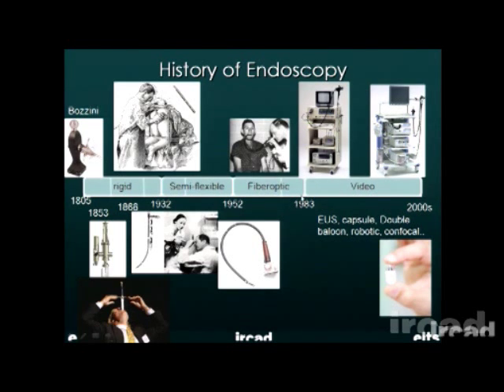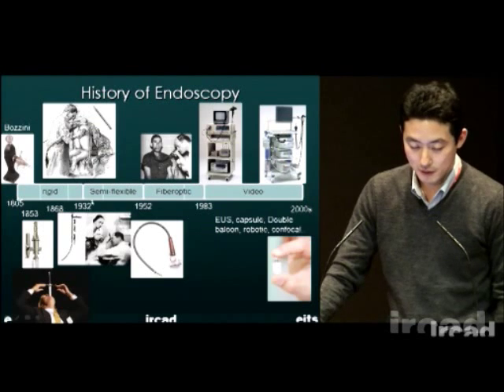In the 1980s, the development of the video endoscope enabled live images to be displayed on video monitors so that other doctors and medical professionals can observe diagnostic and therapeutic procedures as they are being performed. Currently, the rapid development of digital image processing technologies expands the diagnostic and therapeutic potential of endoscopy.